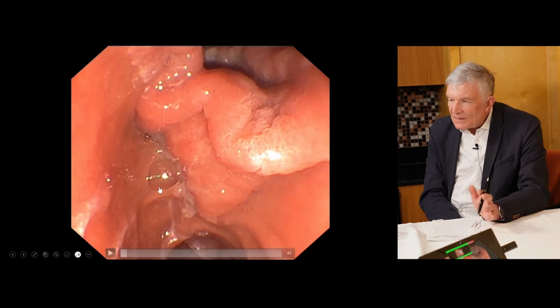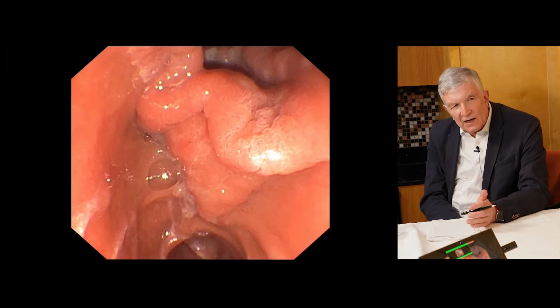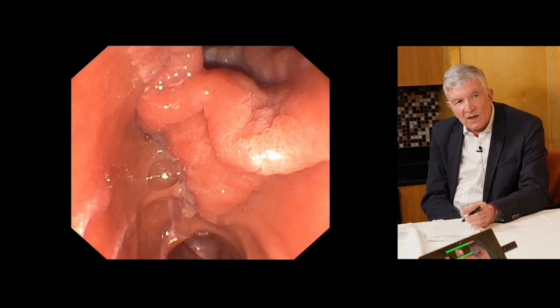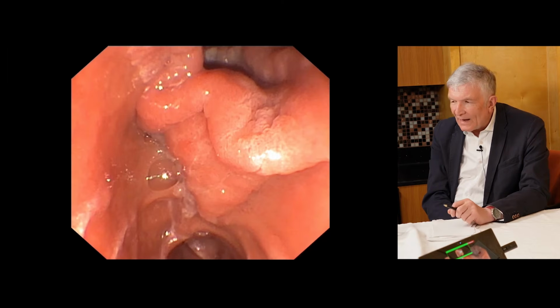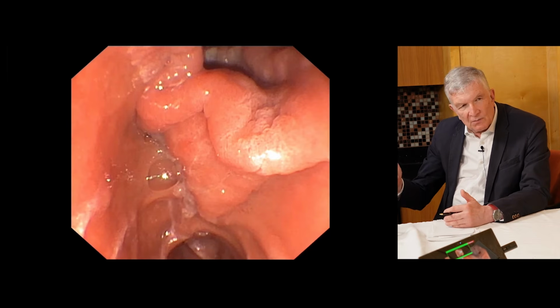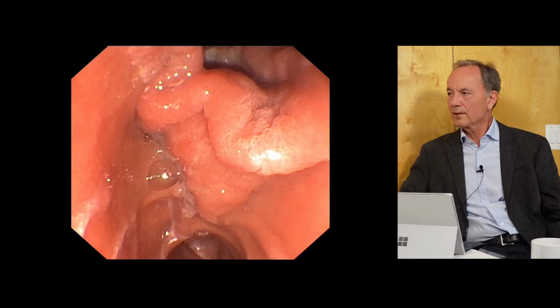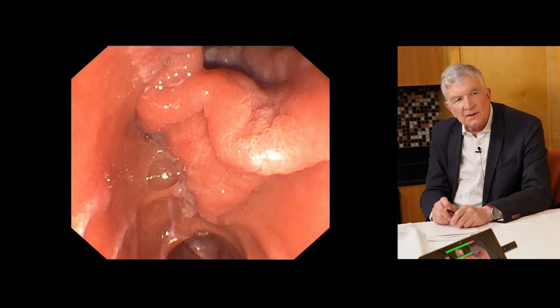Nowadays, maybe it's a sidetrack, but it's a relevant question. Nowadays, there's cold resection as well, which has been suggested to have a much lower complication rate, but it may be that the recurrence rate is higher. Yeah. If you do that, the papilla is still resected hot. So you start with the duodenal part first, and then if you can identify, leave the papilla. Yes. And then for the end. Yes. No matter whether all is hot or it's cold first. No, I do it all hot.